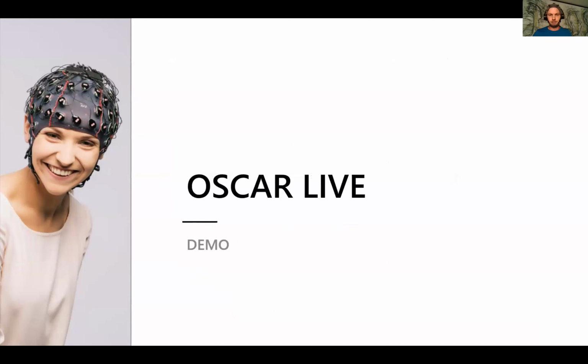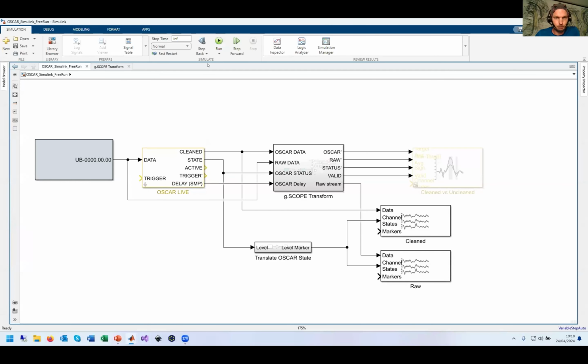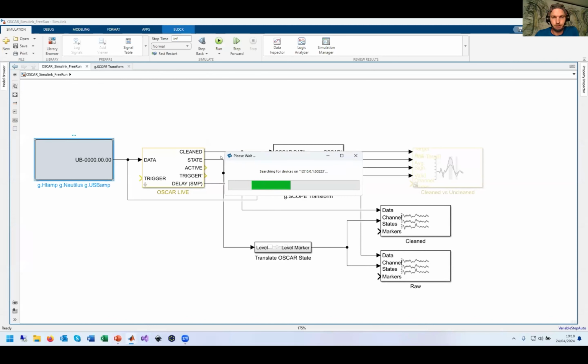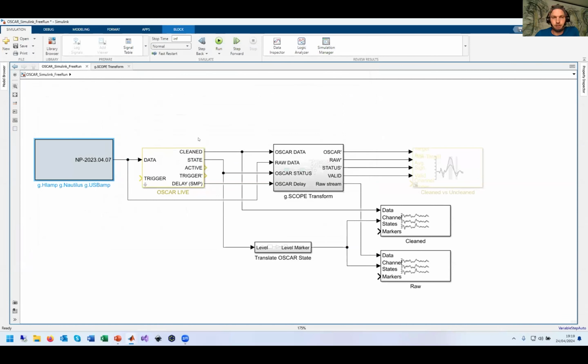Now let's see if we can do this in real time. So I have prepared a live demo. That's why I'm wearing the EEG cap. So right now, I'm here in Simulink. I have the g.Nautilus connected. Let me see if I can access it. Yeah, looks good. So my electrodes we have 16 channels, and all those are gelled at the moment. So we have Sahara hybrid electrodes, from the Unicorn. Basically also works with dry electrodes, but it's a big demonstration, so I don't want to risk anything. So that's why we have gelled it.